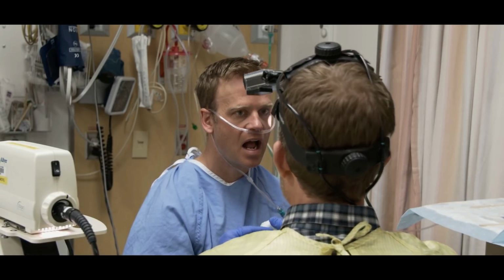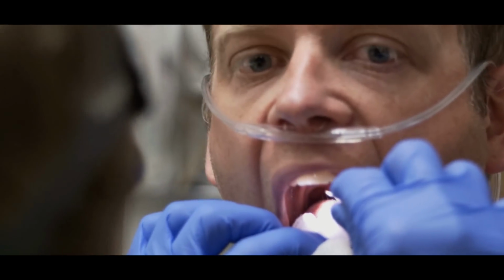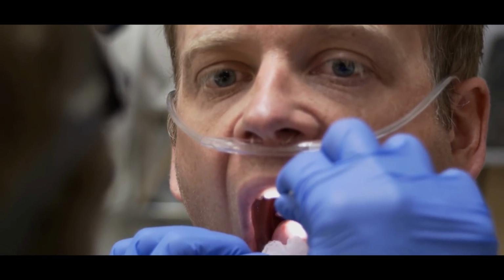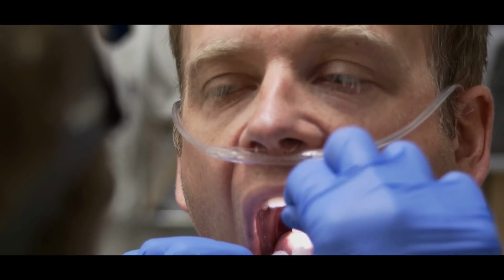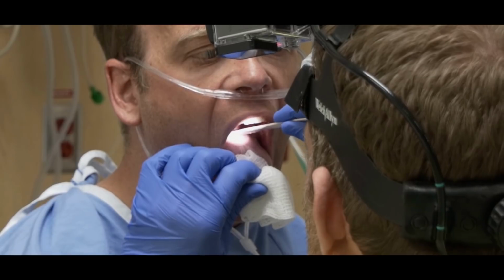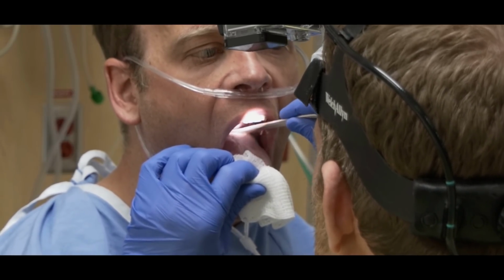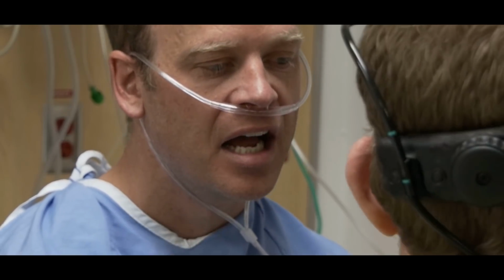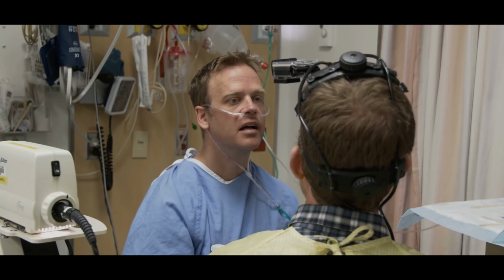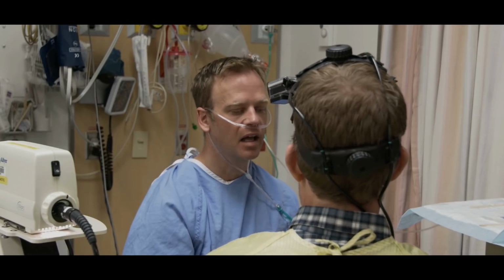Okay, so let's see if we can get any deeper down the tongue now. Excellent, excellent. So just a little more, just going further down the back of the tongue. And now I'm touching the uvula without much response, so that little atomization was beneficial for sure. And that was the tongue that got that, yep. And you can try not to swallow it. Hold it down there, and then when you have to spit, just let me know. Okay.